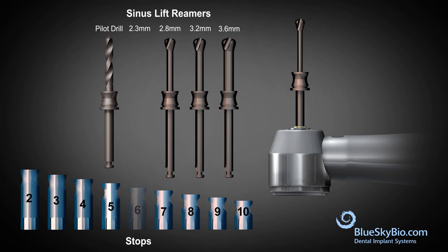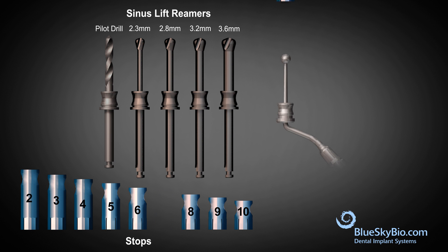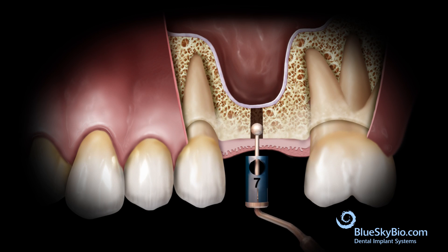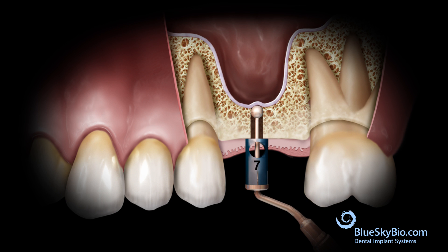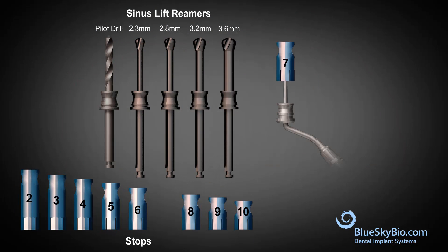The next stop that increases the length by one millimeter is attached to the probe. When the probe advances such that the stop touches the crest, this is an indication that the floor of the sinus has been lifted by the previous depth osteotomy.